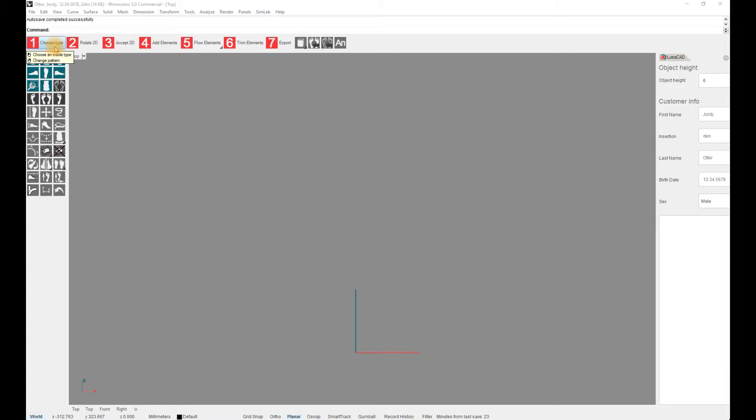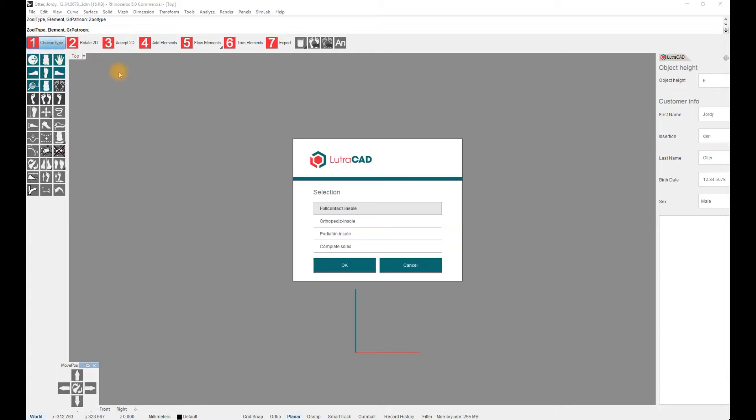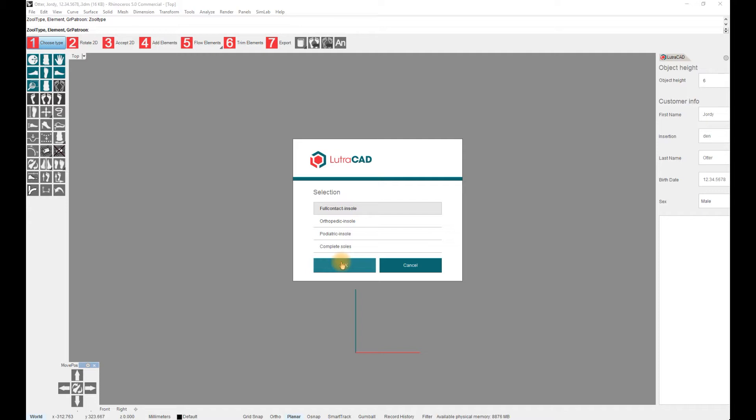We start by selecting the first step, Choose Type. A pop-up message will appear with 4 options to choose from: Full Contact for an insole based on a 3D scan, Orthopedic insole for pre-made 3D insoles, Podiatric insole for an insole based on elements, and Complete insoles for previously designed insoles which have been added to your personal library.